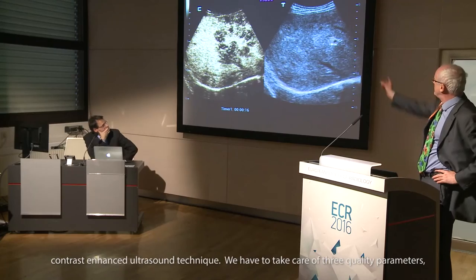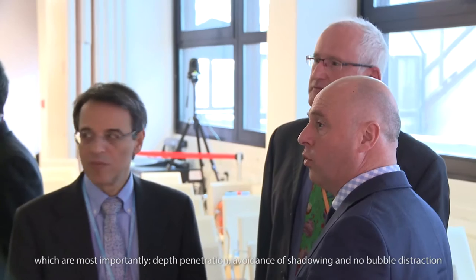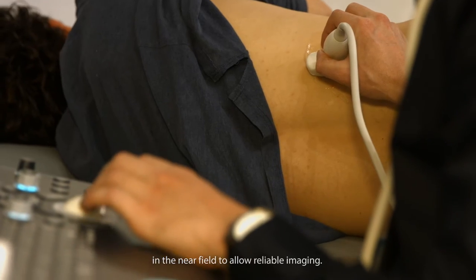We have to take care of three quality parameters: most importantly depth penetration, avoidance of shadowing, and no bubble destruction in the near field, to allow reliable imaging.